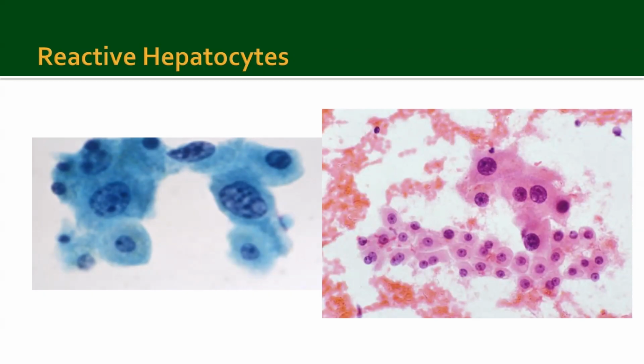So if you're watching the podcast, the image on the right, I think, shows the spectrum very well. You've got your normal small hepatocytes more towards the bottom and maybe towards like 6 and 7 o'clock. They're still relatively on the smaller side, NC ratio, good amount of cytoplasm, and the eosinophilic granules, as Noah described earlier. But then if you look more like 1 and 2 o'clock, you'll get some bigger hepatocytes that are what we would call more reactive, but their NC ratios are still normal.